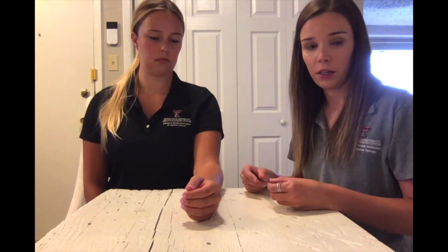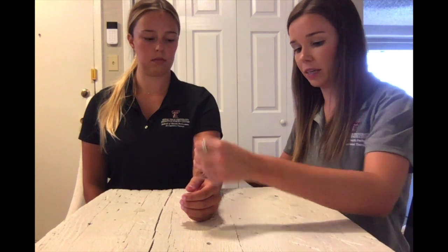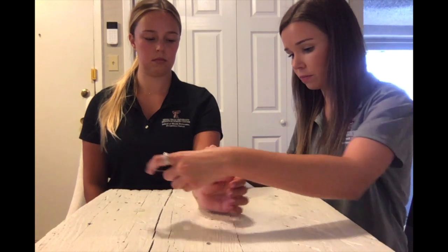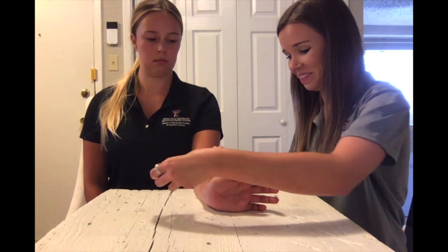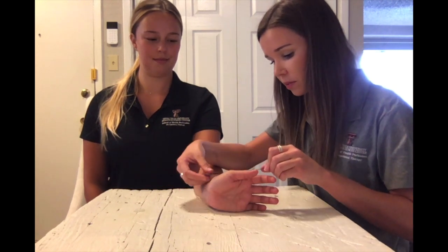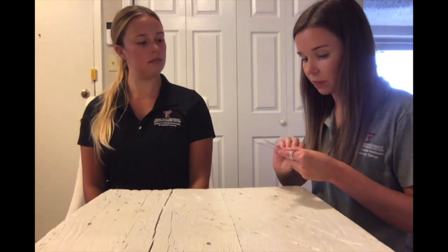For wrist extension, your axis, stationary arm, and moving arm are going to remain in the same position. Addison, I'd like you to bend your wrist back as far as you can go. Addison has approximately 90 degrees of wrist extension; however, the norm for this movement is approximately 70 degrees.